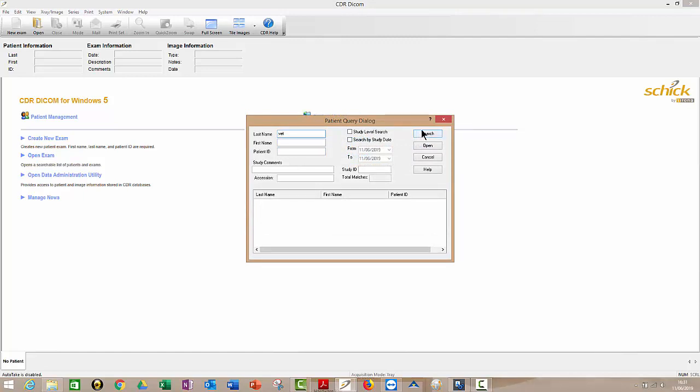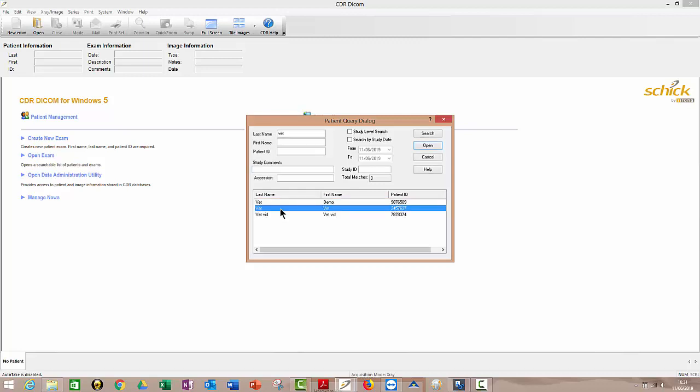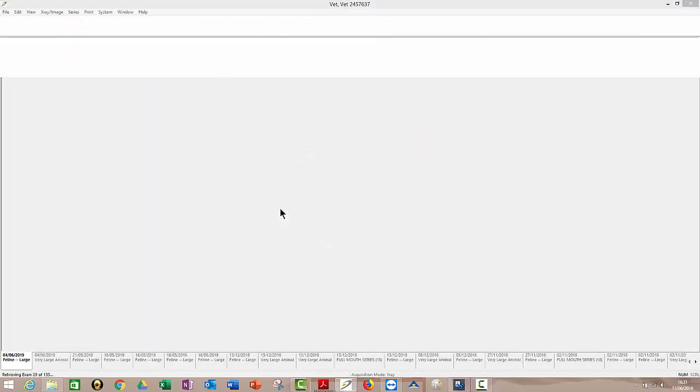So I'll just put in vet for now. So you get the idea, last name, vet. So that would find all my vets, for example, and then I'll just open it. So if that was Smith or Jones, same thing would apply.